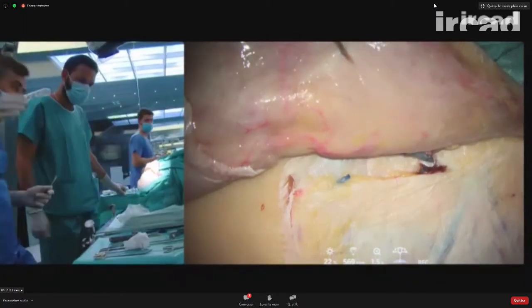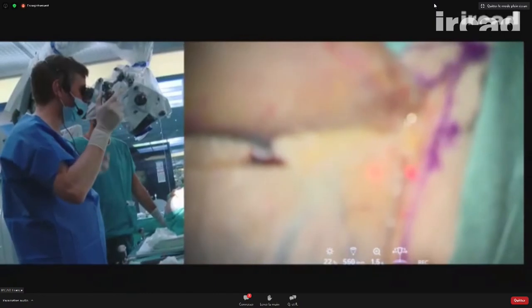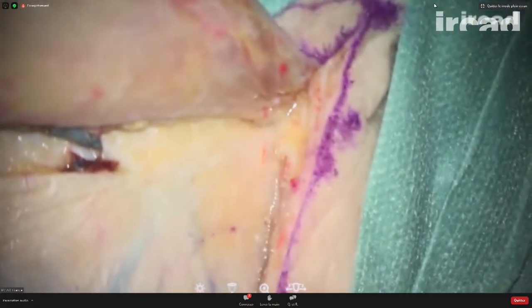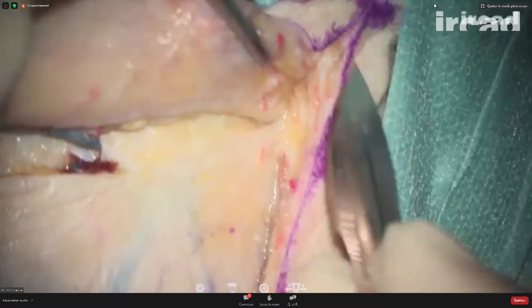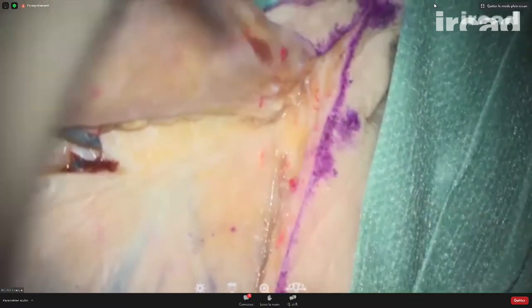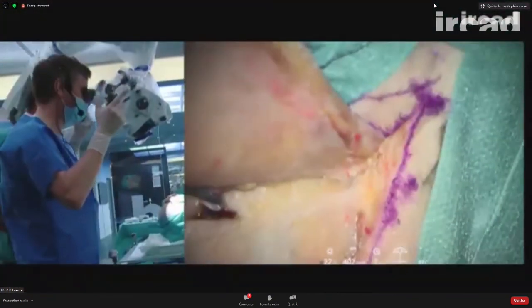Down here, I can release the skin a little bit to get additional retraction of the skin anteriorly. And this is where I have to get close to the tragus.